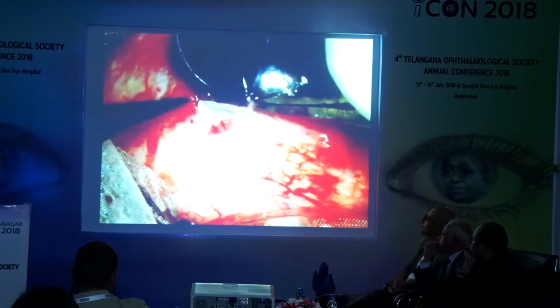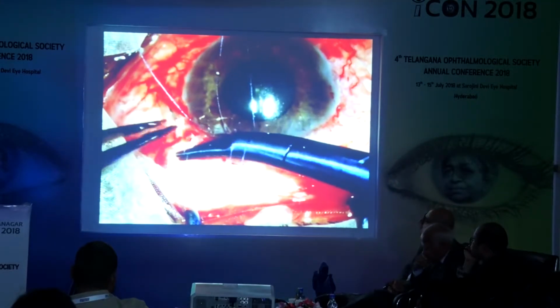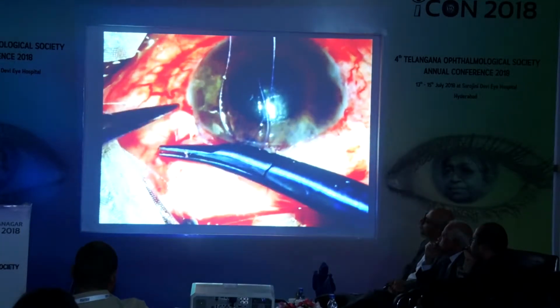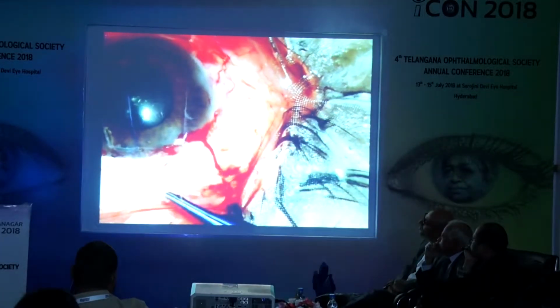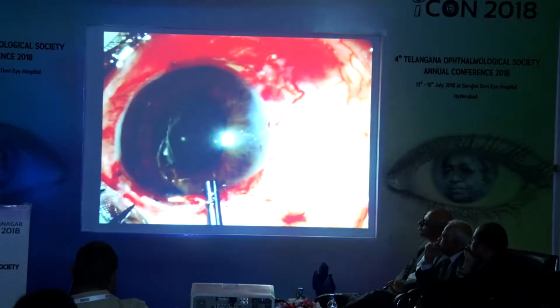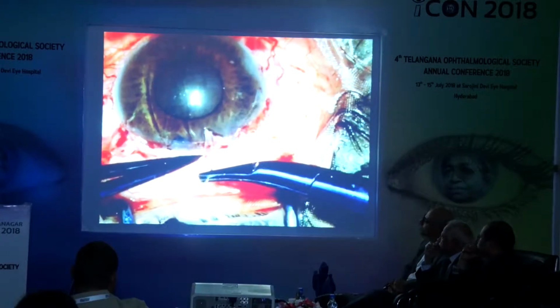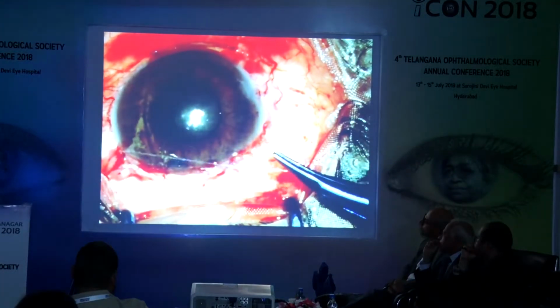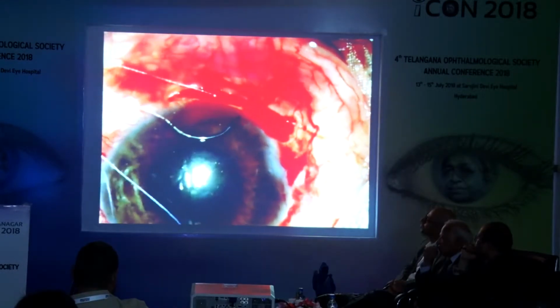Edge was closed with 8-0 Vicryl sutures, interrupted and mattress. Donor site was also sutured with 8-0 Vicryl suture.